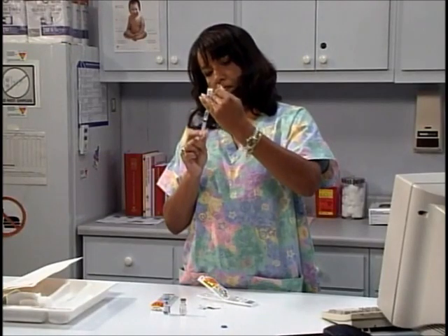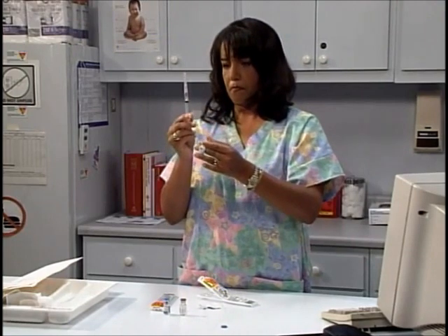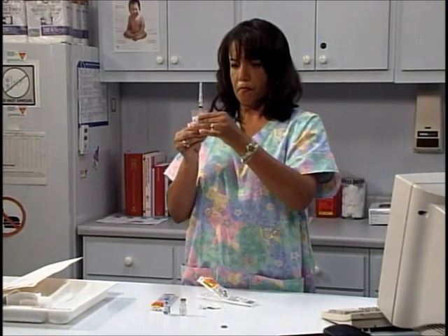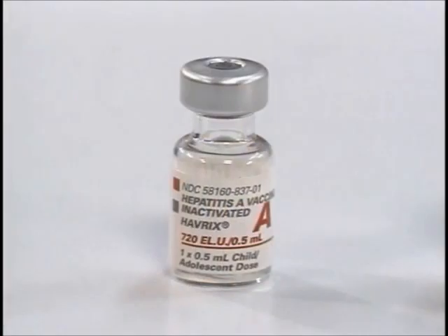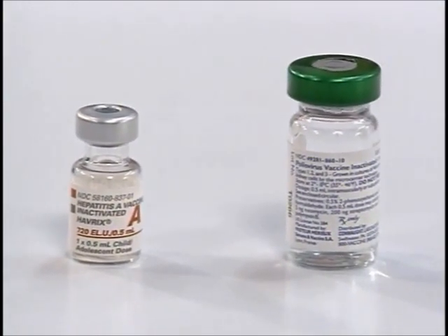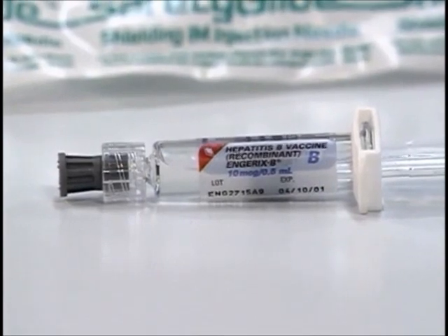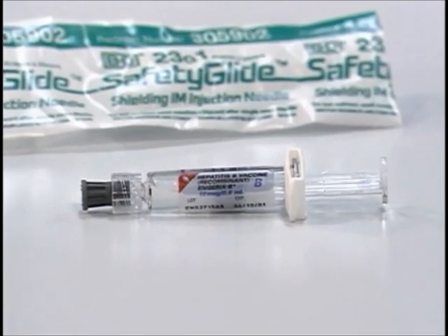Withdraw the needle. Recap the needle. At this point, the needle has not been used on a patient, so it can be recapped. If there are large air bubbles in the tip, expel them by tapping, but avoid squirting out any of the vaccine. If you are using a single-dose vial, draw up the full amount. For multi-dose vials, this same syringe filling technique means accurate measurement and ensures that you get all the expected doses out of the vial. If you are using an IM vaccine supplied by the manufacturer in a pre-filled syringe, make sure you select a 1-inch or longer needle.